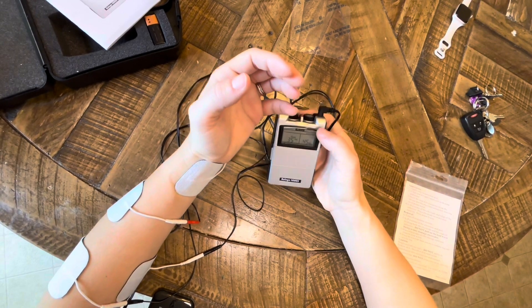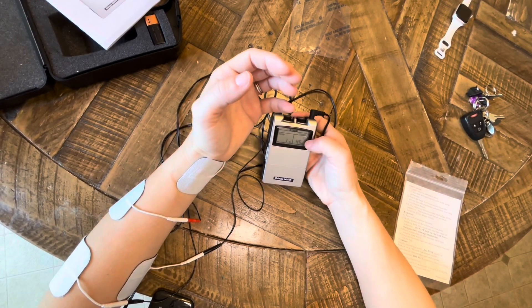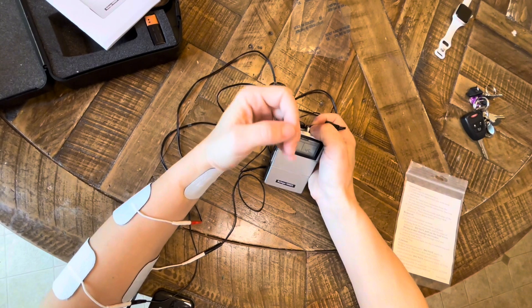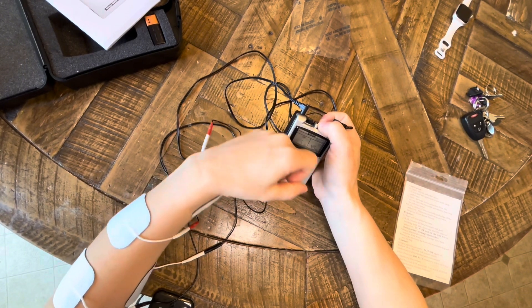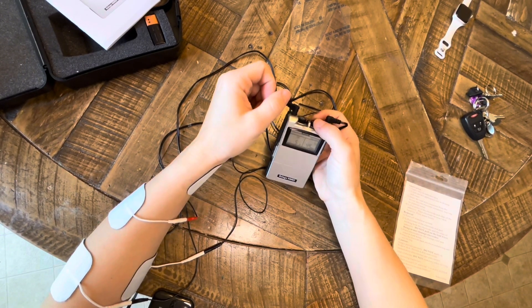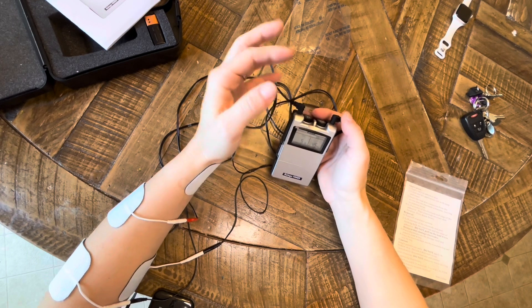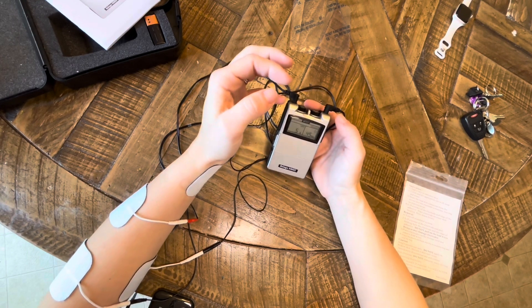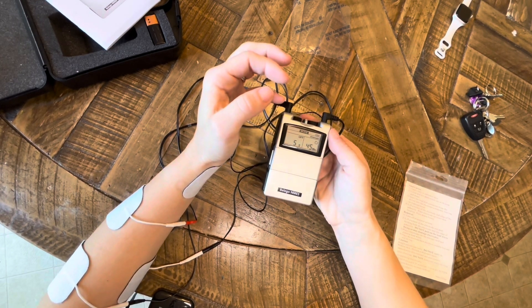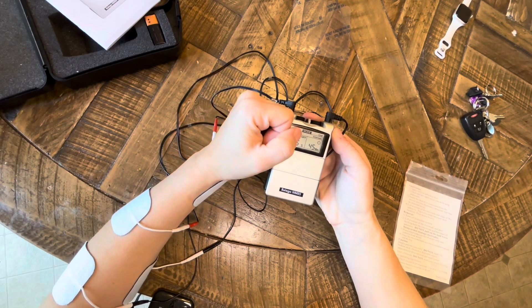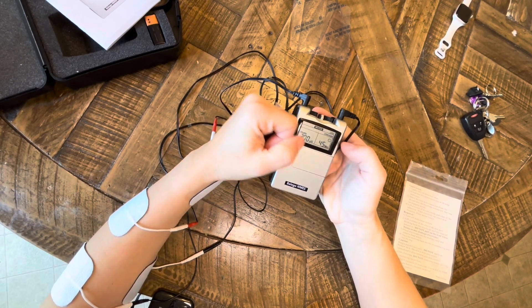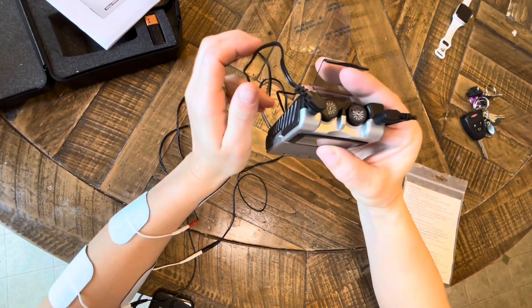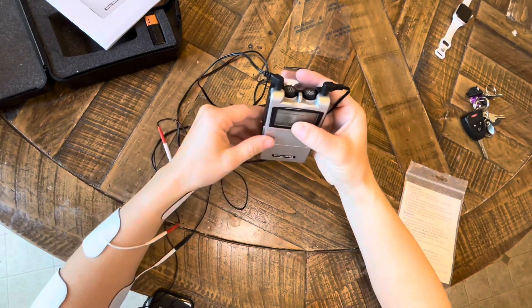So I'm going to start setting up my amplitude for my flexors, and this is kind of really fine tuning for the Belego. If you look at the top dial, it just goes to eight and it does not correspond with the actual milliamps.